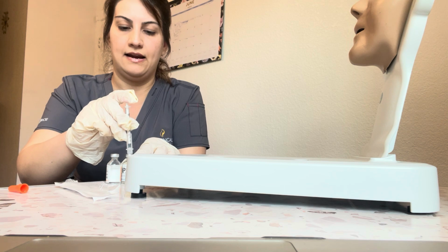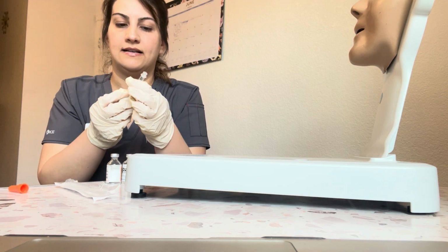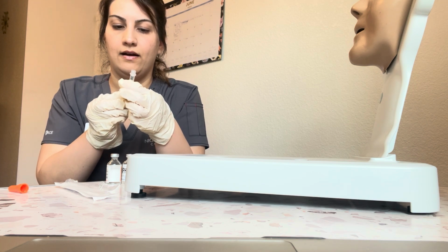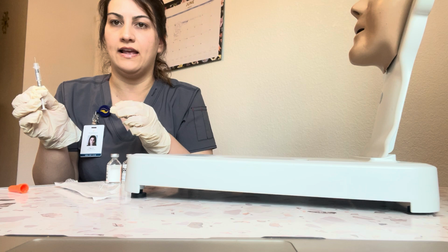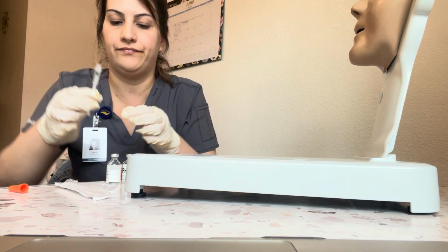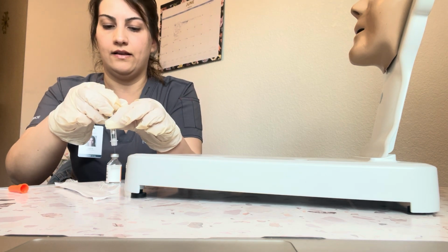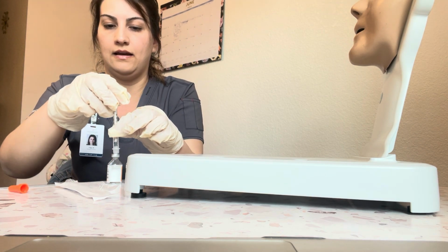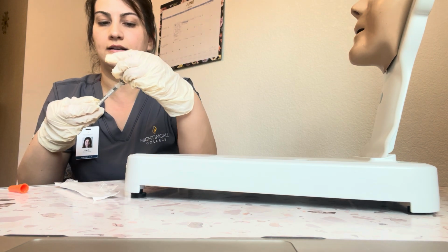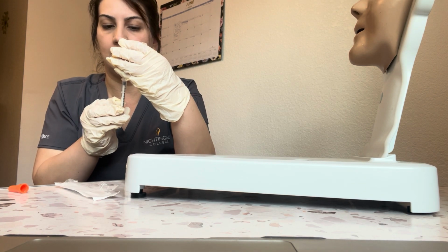Just going to push in the air, not going to draw up the solution. Then next I'm going to draw up the 4 units of air of the regular. Nurse and I verify against the mark 4 units of air. I'm going to inject that into the regular insulin. And then at this point I can tip it over and I can draw up the solution of the regular insulin.